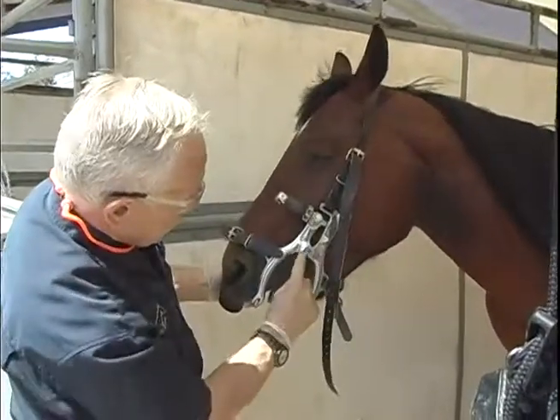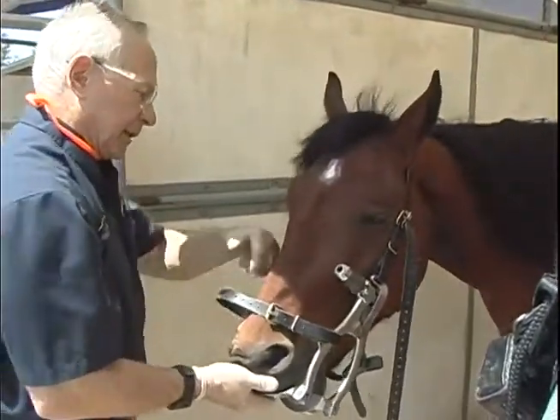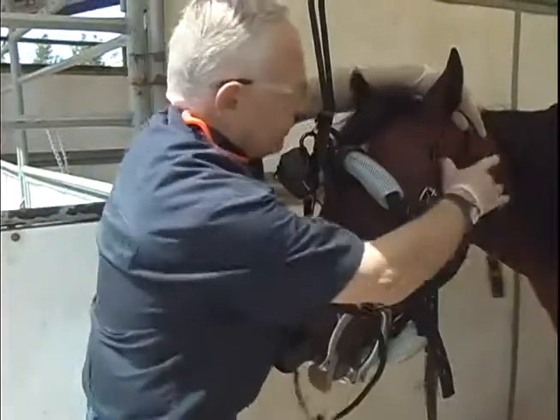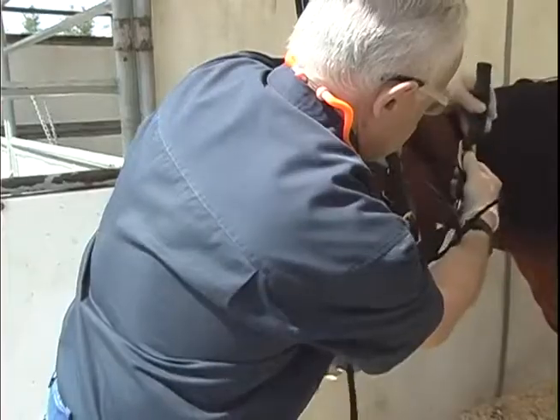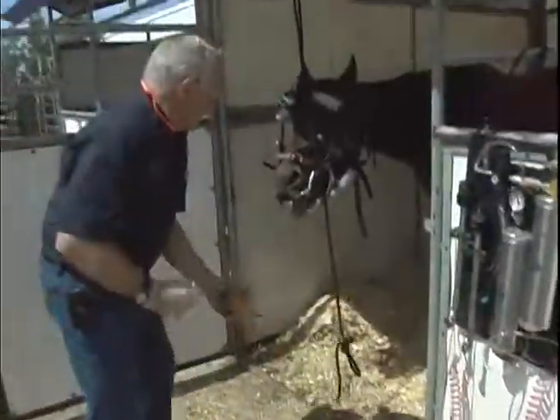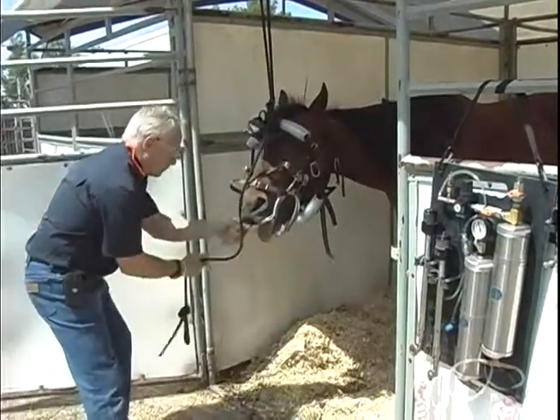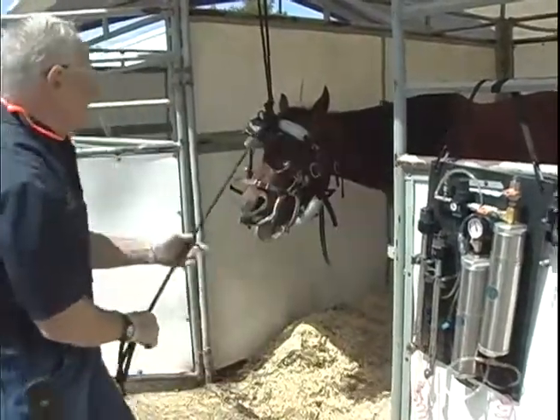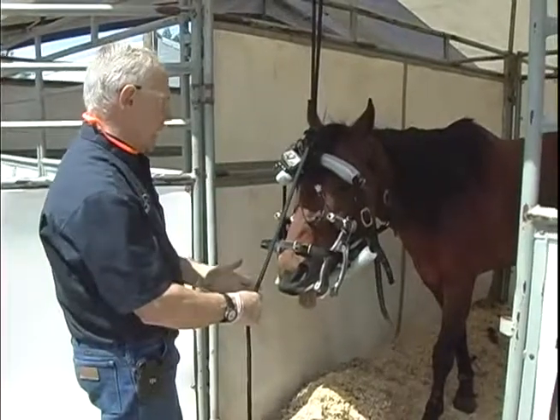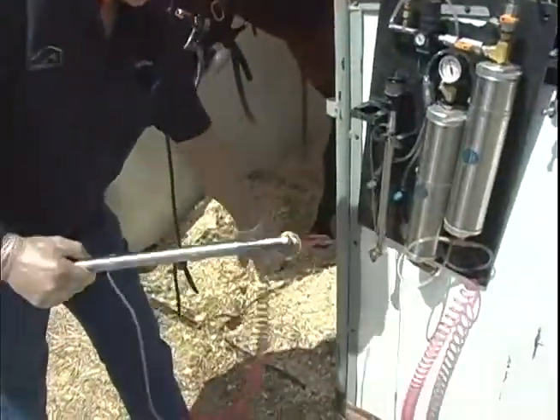When I look on the side, an arrow will line up to tell you when you're open, but I know from looking at the shaft when I'm about there, I'm at 3.5 inches as far as open. So now I'll simply put the horse's head in the dental halter. Then I'm going to wash the mouth out by shooting the water against the cheeks. And when I'm ready to start to float, I simply lift up the head and put the light on and start to float.